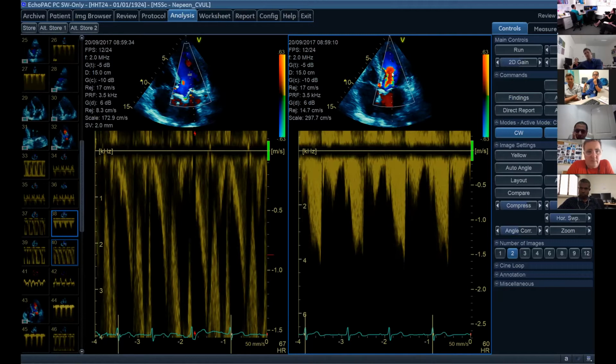All right. So the next thing we've got to talk about, when someone's asking how you assess the aortic valve, you've got to know the advantages and limitations of each parameter. So what's the advantage of continuous wave Doppler in assessing aortic valve stenosis? Why do we use it? So we use it to identify the amount of turbulence that would be at the LVOT. Yeah, and it's not the LVOT. For aortic stenosis, it's going to be obviously in the aortic valve. And the valve itself, yep.